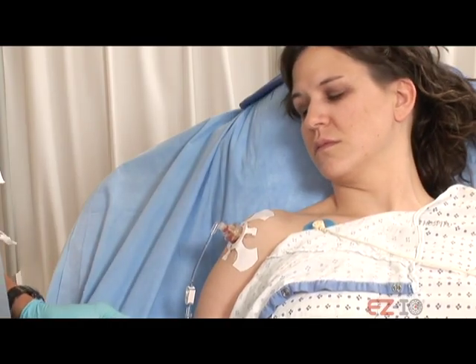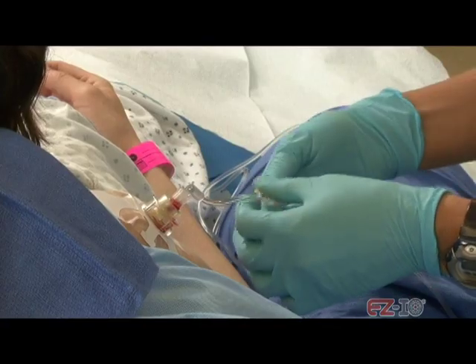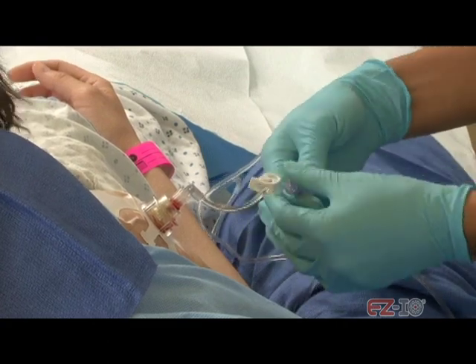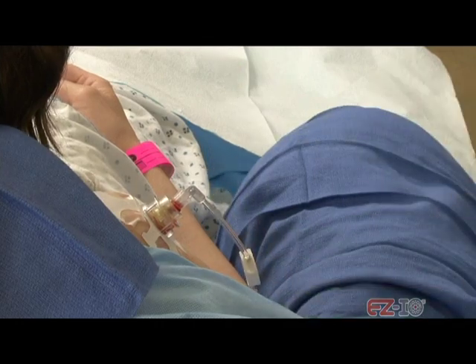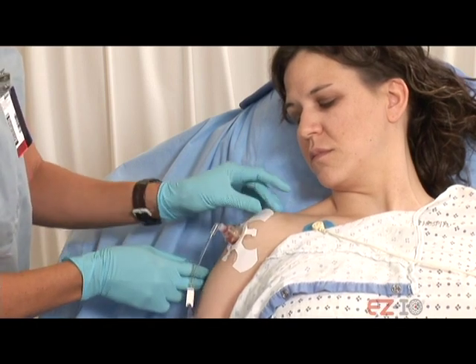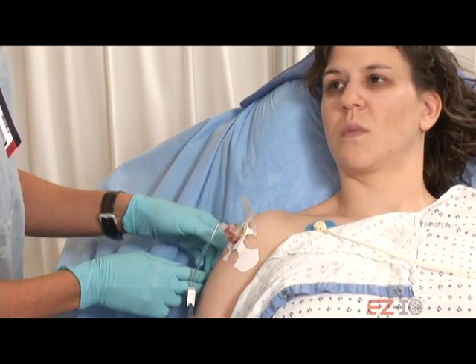Okay, Karen, we're ready to get this out. So I'll just walk you through the steps as I'm doing them. So I'm just shutting off your IV. I'm just going to take that apart right here. Okay, and now I'm just going to peel this back. All you're going to feel there is just that tape coming off your skin.